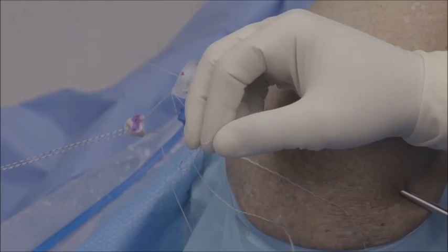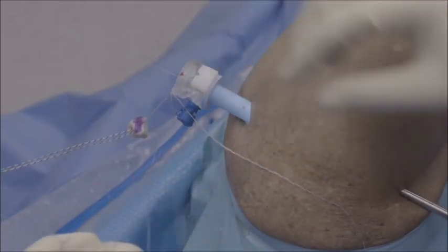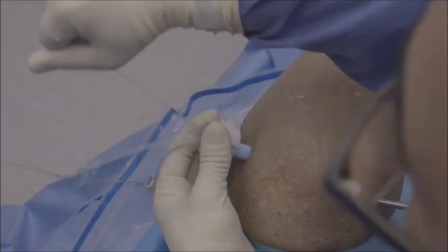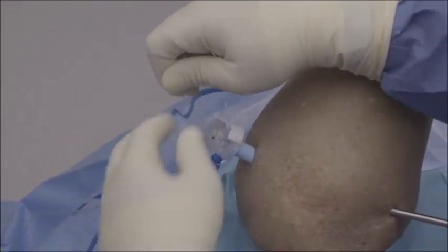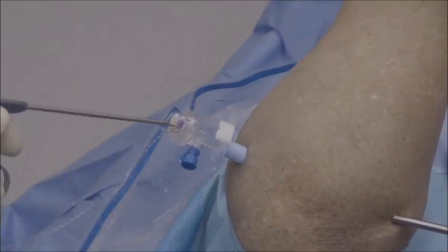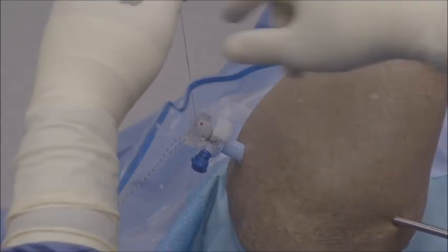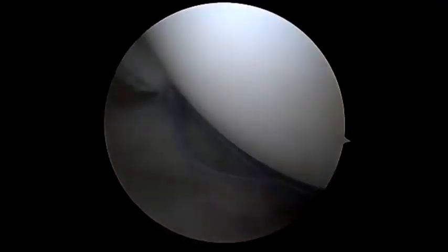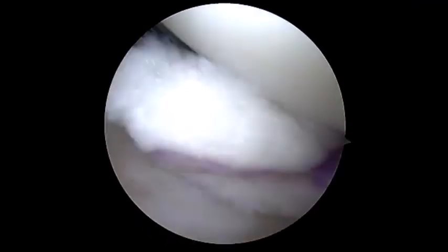The graft is then brought to the field where the repair stitch is loaded into the anchor. Once the repair stitch has been loaded and passed through, a grasping device will be used in order to introduce the graft past the dam of the cannula. At this point, both the repair stitch and the traction stitch are used in order to take slack out of the repair as the graft is slid into its appropriate position into the shoulder.